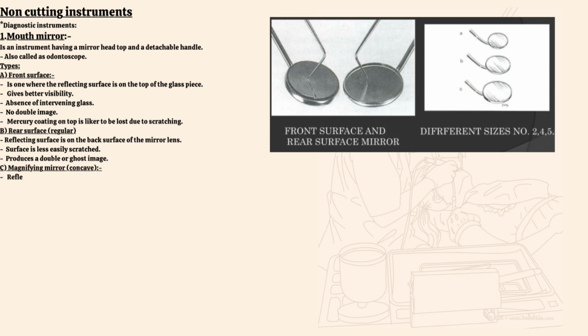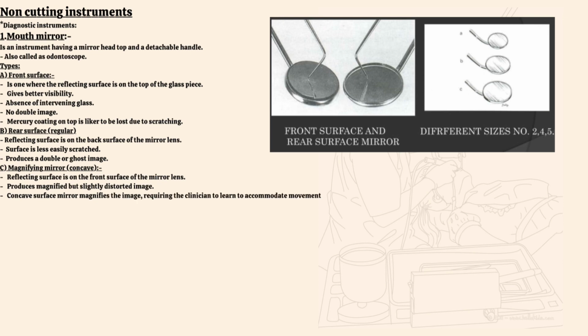C. Magnifying mirror, concave. Reflecting surface is on the front surface of the mirror lens. Produces magnified but slightly distorted image. Concave surface mirror magnifies the image, requiring the clinician to learn to accommodate movement. Concave mirror rarely used except for seeing enlarged internal details of the cavity.